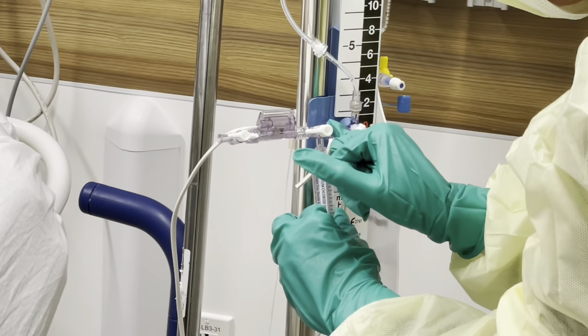This valve is open here. You can flush. You're only flushing the transducer right now. Okay, just enough like that. Once you get that flushed through, you're going to turn it off, so that way you can't flush that way anymore. See, can't flush that way anymore. Nothing's going in, nothing's going out. You're going to put a little blue cap on it.